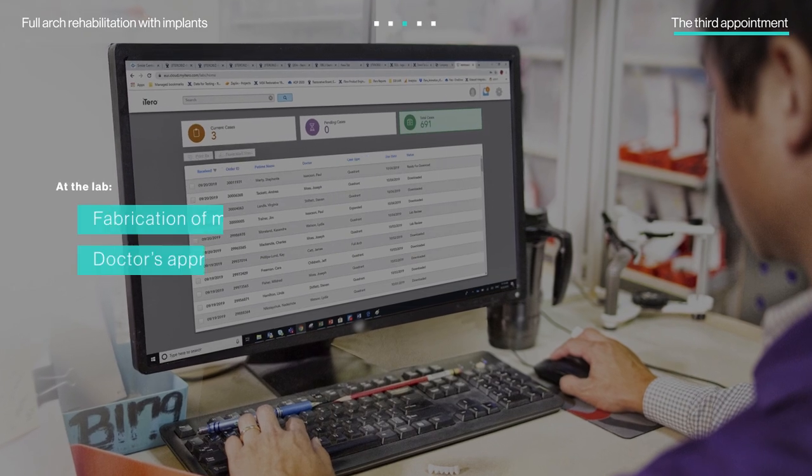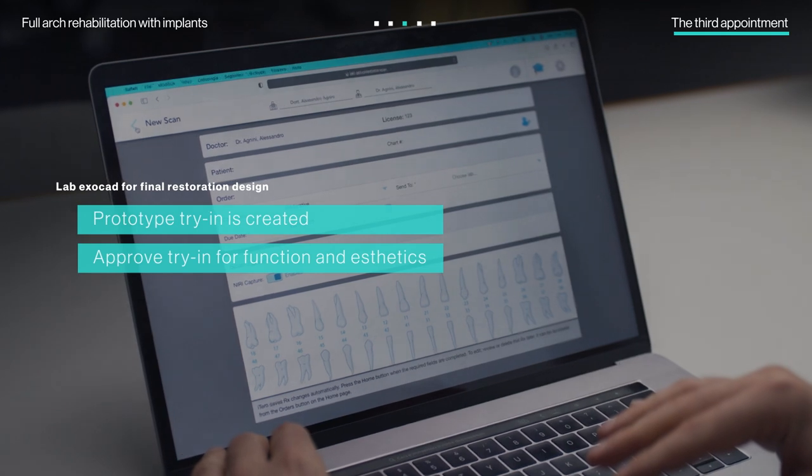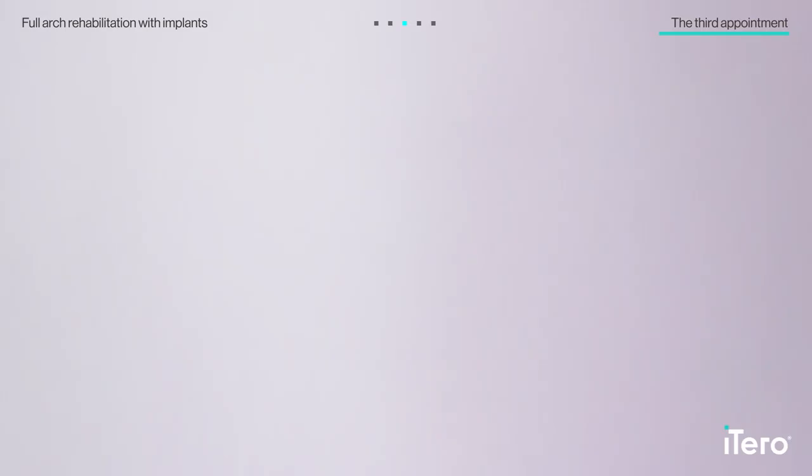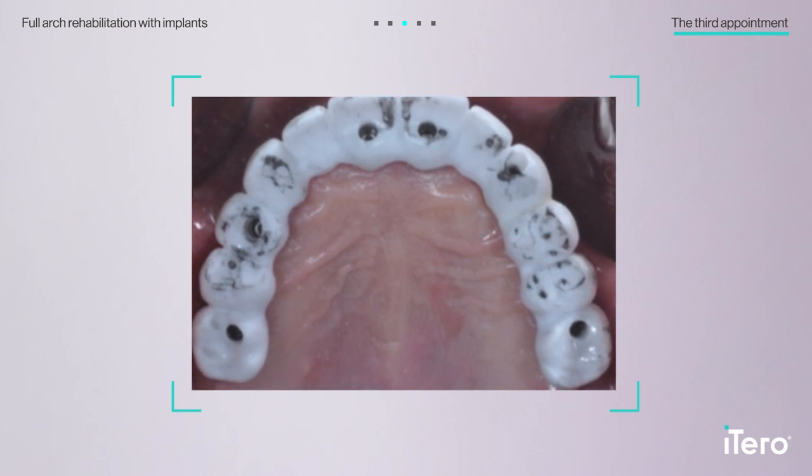Back to the lab for the final restoration. The lab fabricated a metal bar for the foundation and also fabricated a PMMA prototype try-in. With the doctors' approval, the next appointment was scheduled.